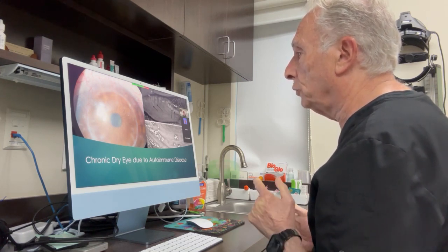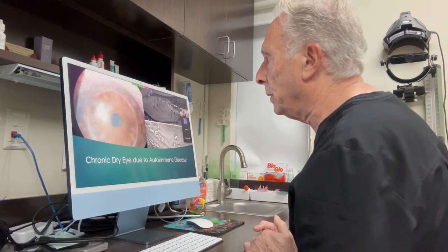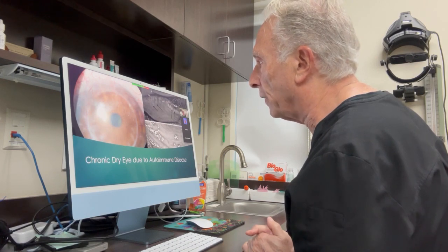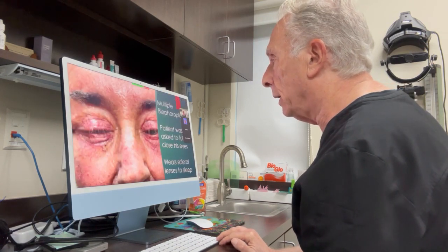And this is the second transplant that this patient had to undergo. But the eye has been quiet for quite a while. If you look carefully, you can see some neovascularization going on to the donor cornea. That's not really a good sign. We don't want neovascularization on a donor cornea. So that's that on that.